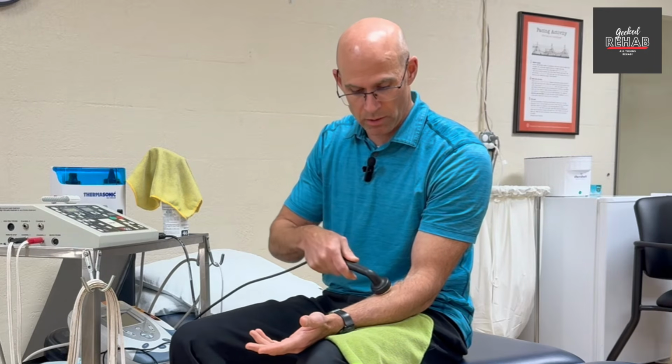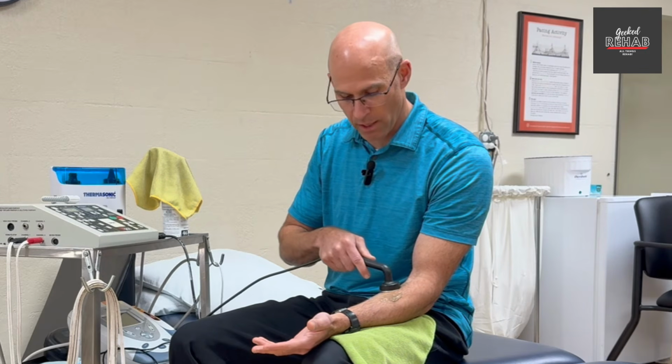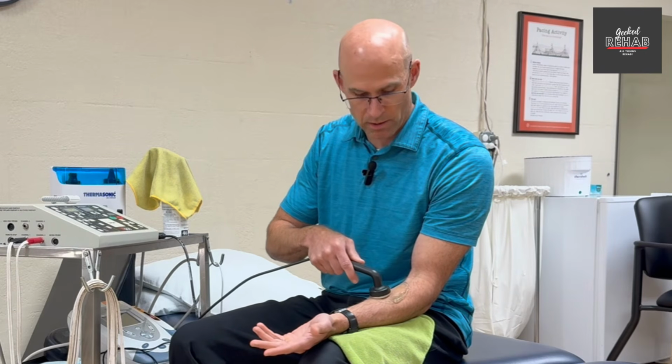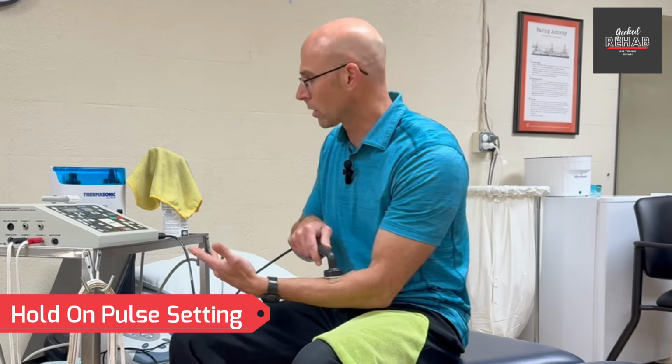That's not what we want. We don't want to heat up the bone tissue. If we want heat, we want to get that moved around. And if you have a deep ache, don't be afraid. It's okay. We just need to move that ultrasound head around. So basically, this is how we do it. This is our area that we're going to treat. It's a small area. And now if we want it on a pulse setting, a very specific area, then we can turn it to a pulse setting and just hold it right there.